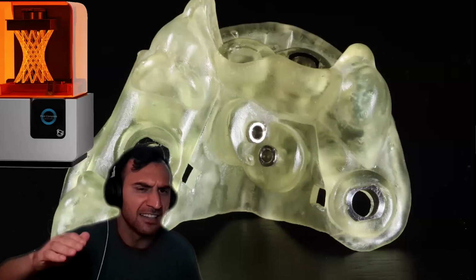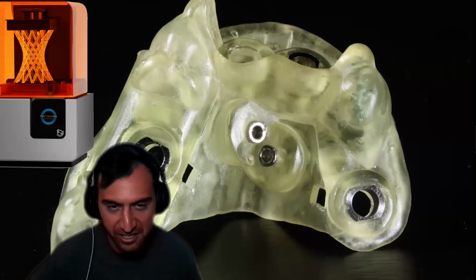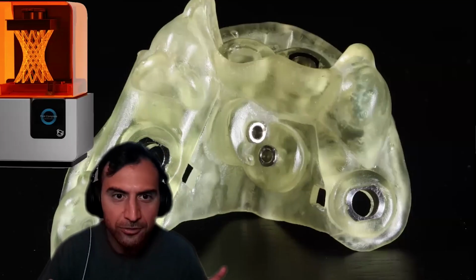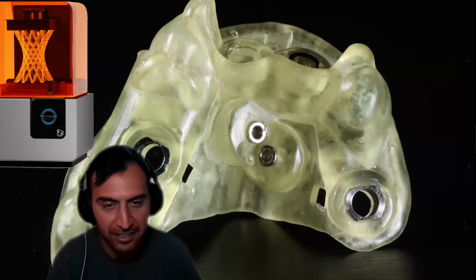Formlabs still exists. They're on their Form 3B, whatever. There are 10 renditions in. The SprintRay is this type. The Prime Print, the Carbon, almost all main dental printers utilize this type of resin.